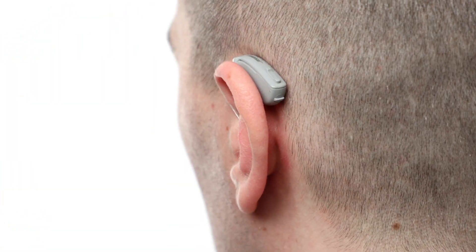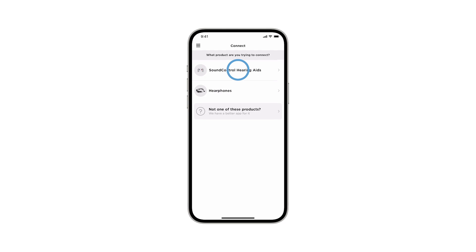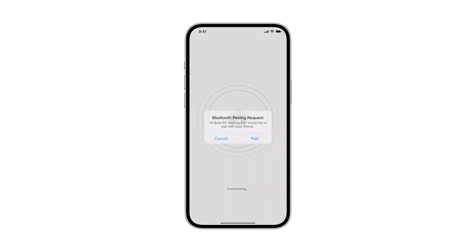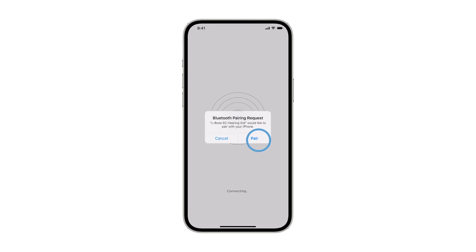With the hearing aids powered on, you can now open the Bose Hear app. If you're asked what product you are trying to connect, tap Bose SoundControl Hearing Aids. A scan will begin searching for your hearing aids. Tap Pair to connect the first hearing aid, and then tap Pair again to connect the other hearing aid.